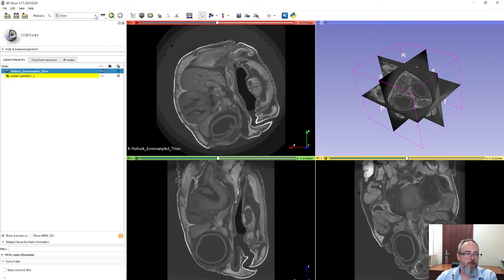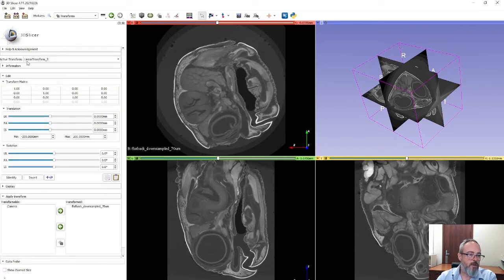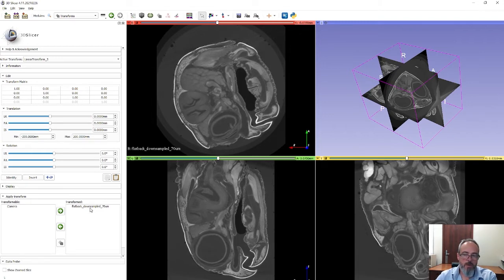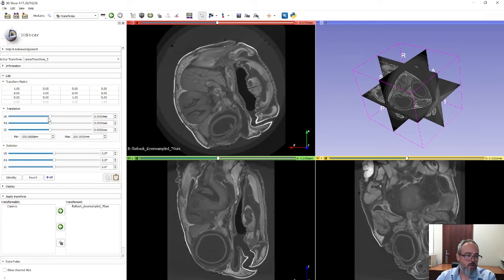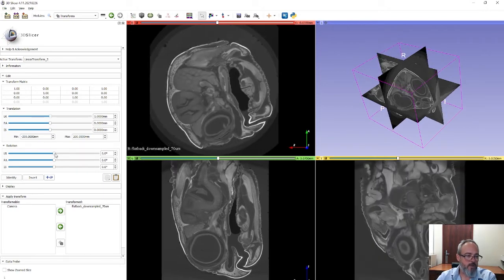Now go to the Transforms module. If any of these are not visible in the drop-down list you can search for them using the search tool and place them as shortcuts across the top. The linear transform should be in the Active Transform menu at the top, and you should have the Flatback Downsampled data in the Transformed list. We can now use translations and rotations to position the data. We're not going to worry about translations today — we're going to focus on rotations.